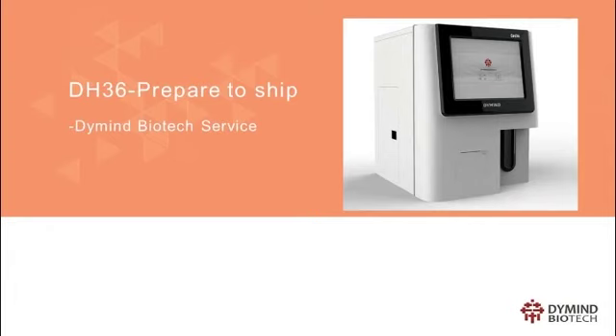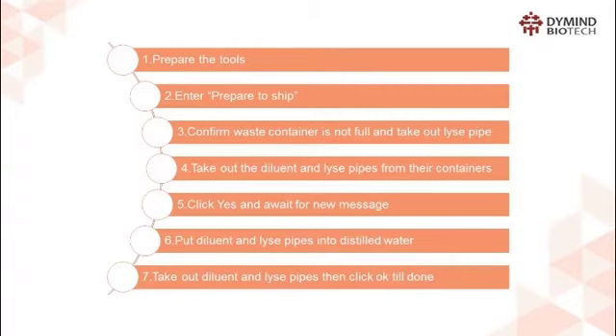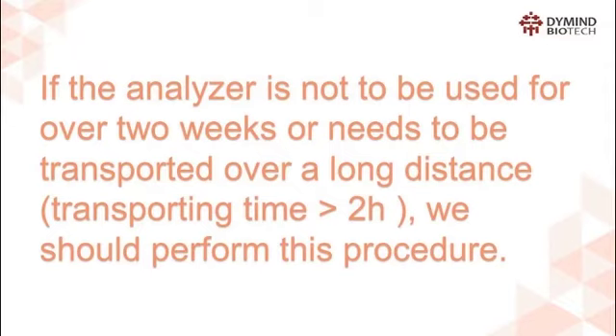DH-36: Prepare to Ship. We would like to introduce how to perform the Prepare to Ship procedure for DH-36. Here is the overview — totally 7 steps. If the analyzer is not to be used for over 2 weeks, or needs to be transported over a long distance or transporting time over 2 hours, we should perform this procedure.